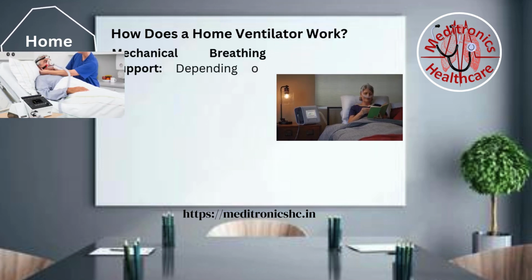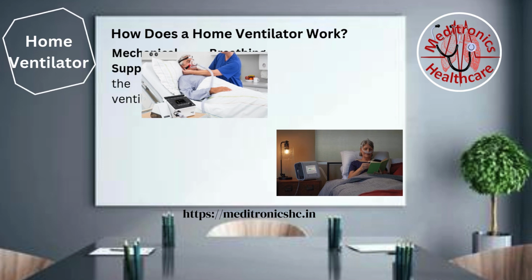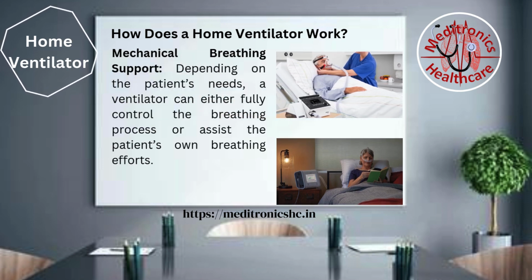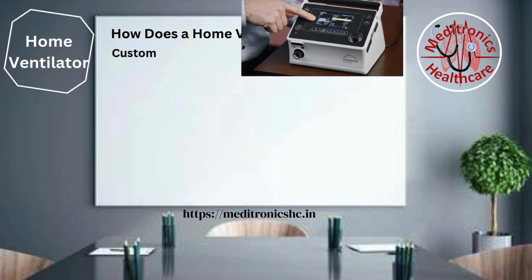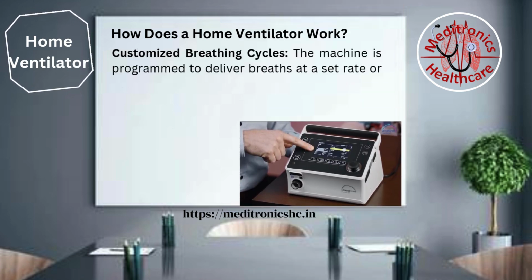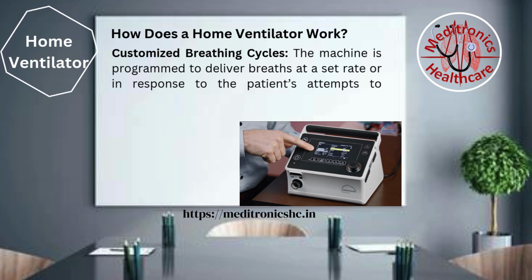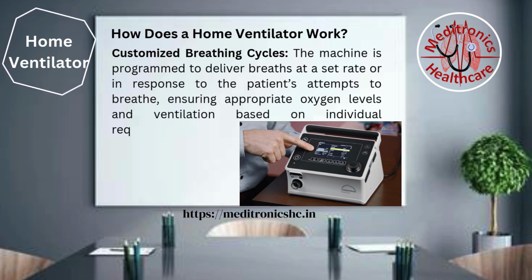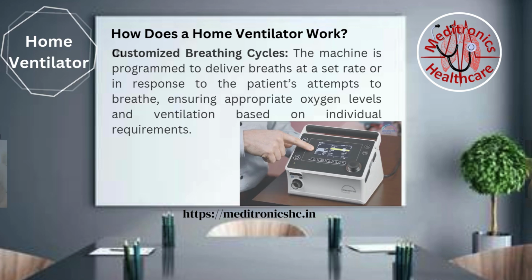Mechanical breathing support. Depending on the patient's needs, a ventilator can either fully control the breathing process or assist the patient's own breathing efforts. Customized breathing cycles. The machine is programmed to deliver breaths at a set rate or in response to the patient's attempts to breathe, ensuring appropriate oxygen levels and ventilation based on individual requirements.